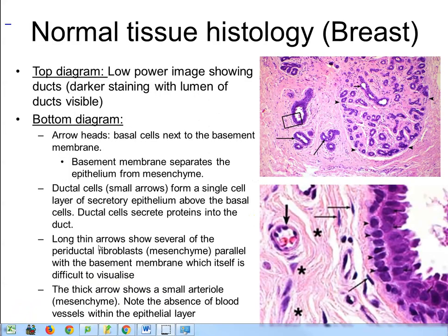We are going to be looking at breast cancer, so I'm going to take you through breast histology — the normal tissue arrangement of cells within the breast. This is a low-resolution image of the breast stained with hematoxylin and eosin. The pale pink regions are your connective tissue — I'll refer to them as mesenchyme, stroma, connective tissue, or fibroblasts. The dark purple areas are your epithelial cells forming tubules. The epithelium lines the tubules, secretes proteins into them, and these all collect together into larger collecting ducts.